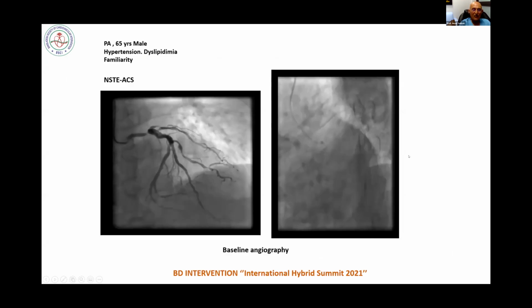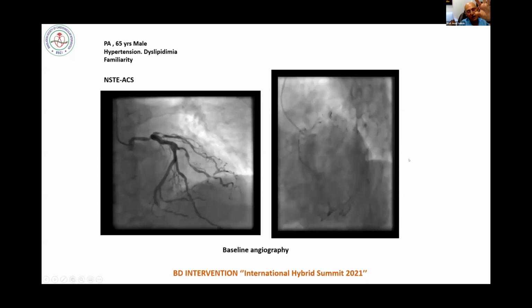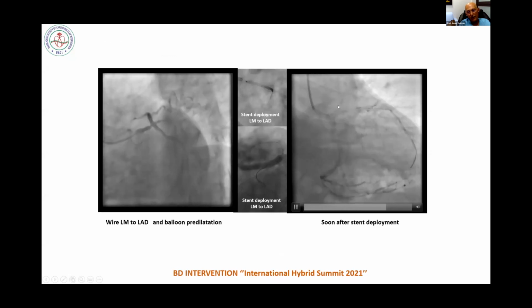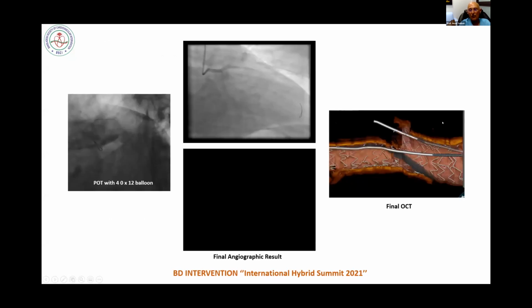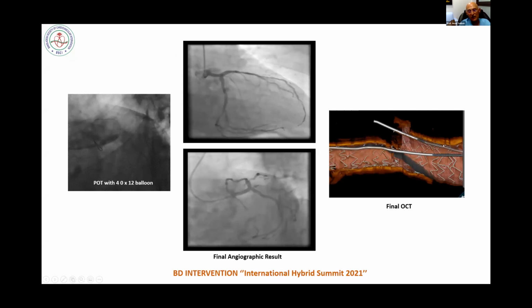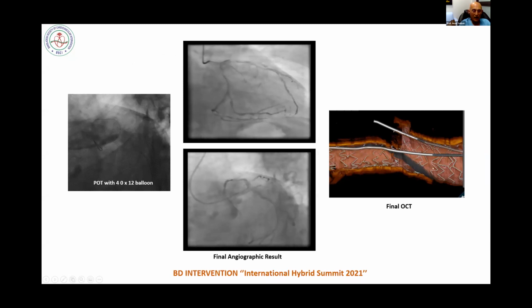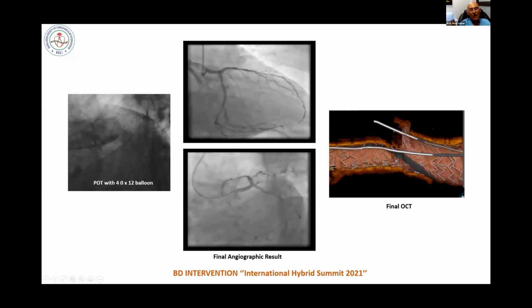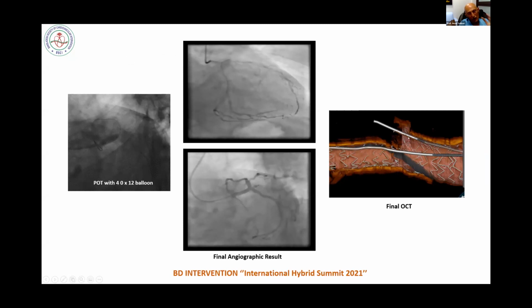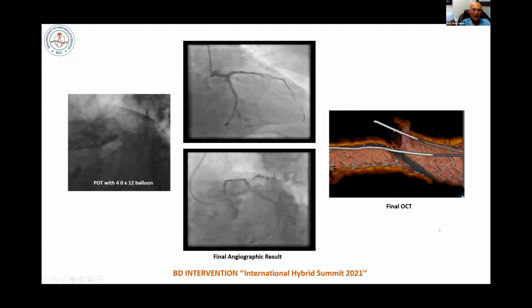Again, this is another good example for single stenting, since it is limited only to distal left main and only single vessel involvement. And again, check on your final result. You should have something like this: full expansion of the stent in left main, and full expansion where it's crossing over, but the conformability of the stent at the bifurcation is perfect, as you can see here.